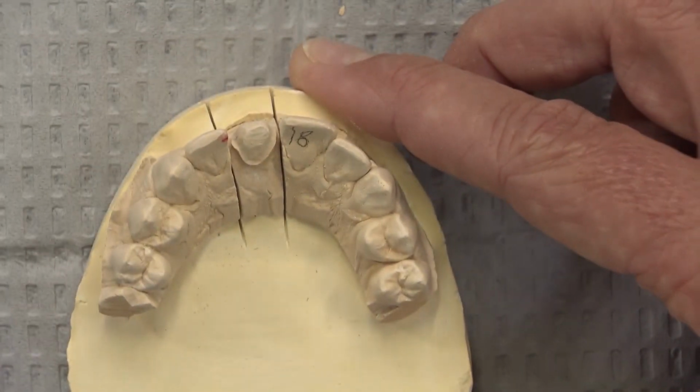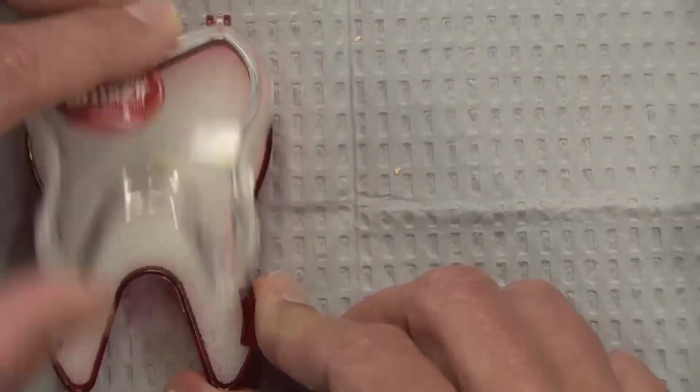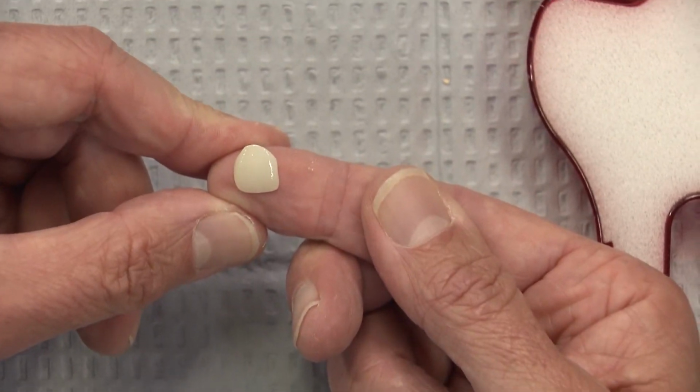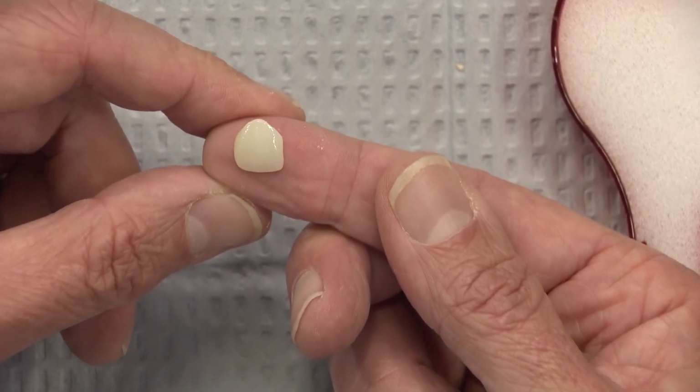So far, a really great job from the dentist, and we sent the dentist an anterior BruxZir crown. Let's take a look at that. Maybe hard to see here, but it's definitely a little more translucent than regular BruxZir.